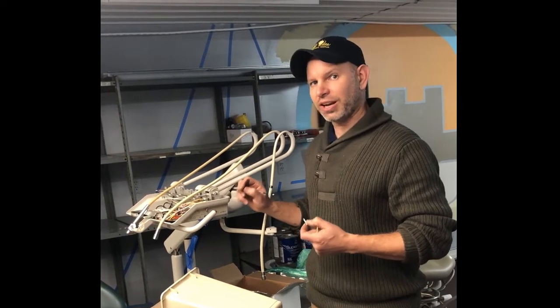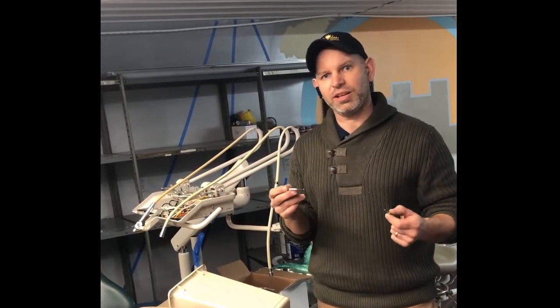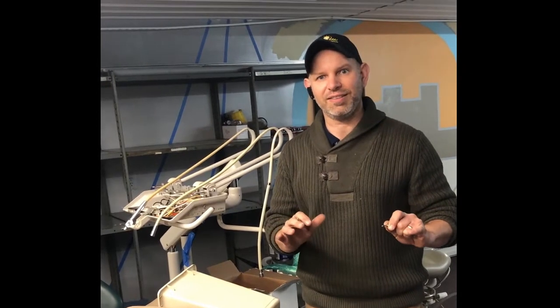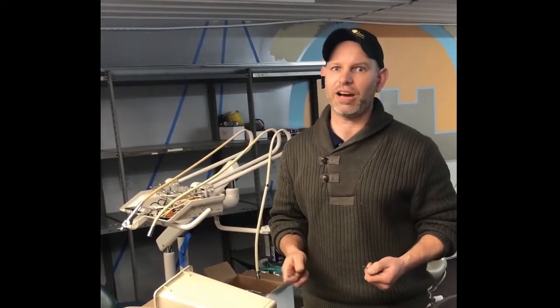unit control block itself. Now, earlier we had tried this with a drill and we were able to get it out, but we just found a way that is so much better than that, and it blew our minds. So I want to show you what it's going to take to get it out.